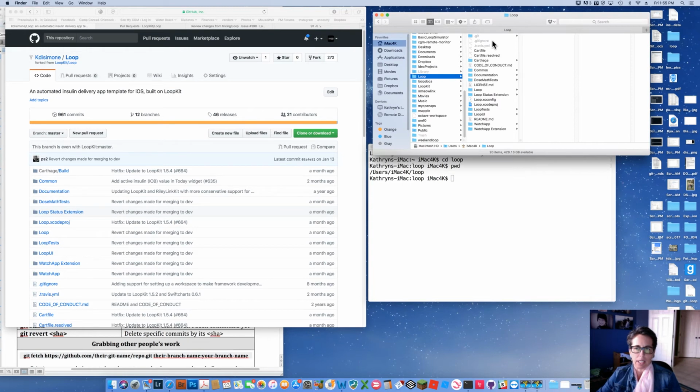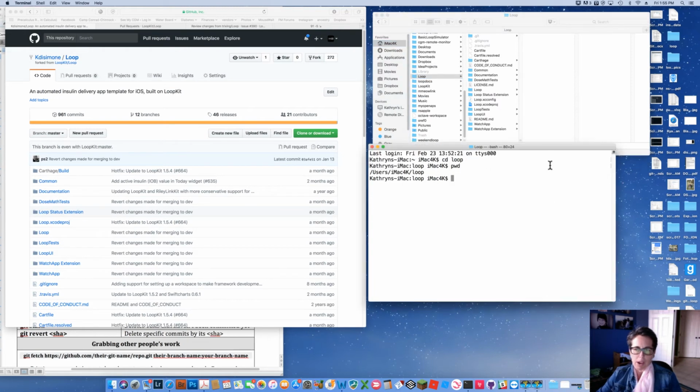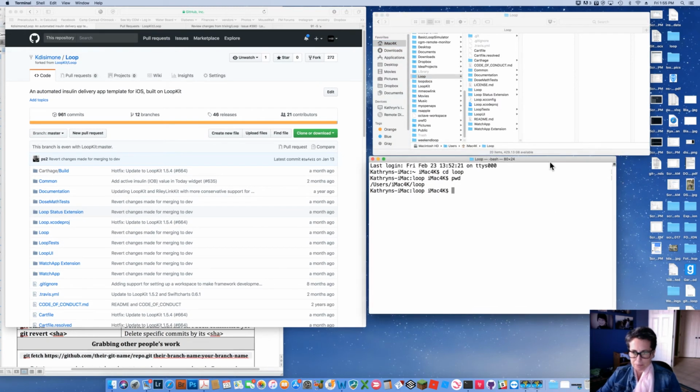Yes, this is my Git directory for my online loop repository. And I can just make sure that I am indeed still connected to the right version that I want to be. Yep, I'm still connected in this directory with my online GitHub account for Loop, which is great. I also probably want to double check which branch I'm on. Let's see which branch I'm on by Git branch. Oh, I was doing some work when you guys didn't see, and I was on Alpha branch.